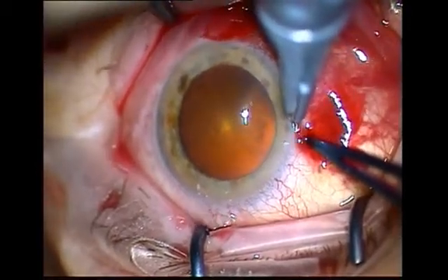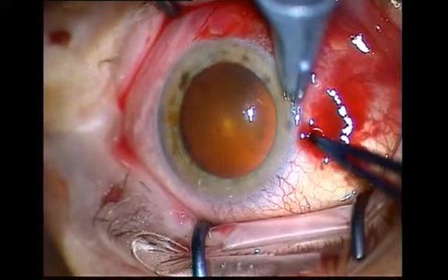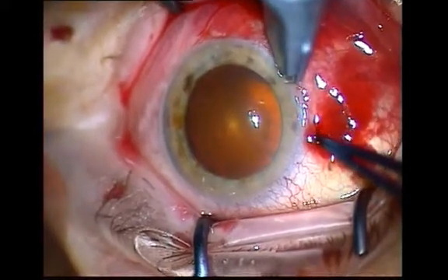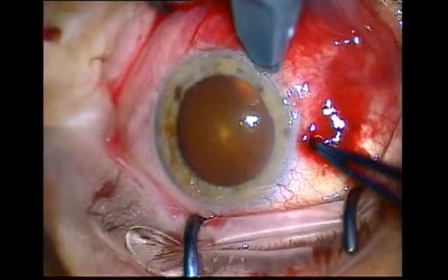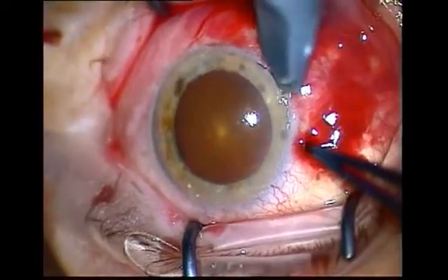In this video, the obvious hemorrhage means that the cut was carried out within the limbal blood vessels. This can sometimes reduce the predictability of the outcome due to more rapid healing.